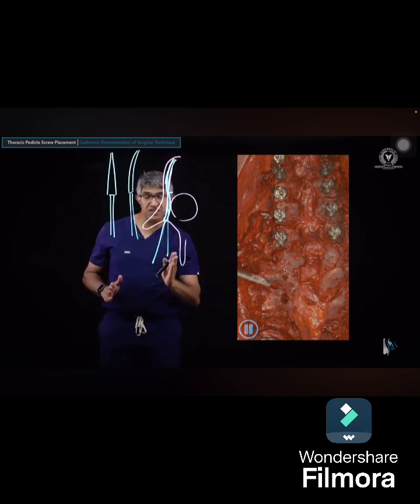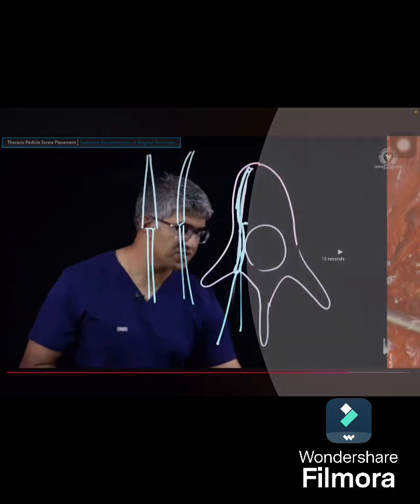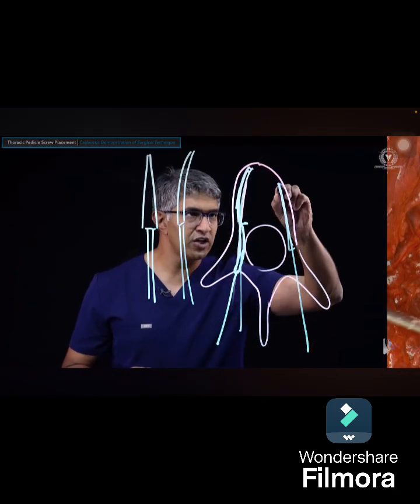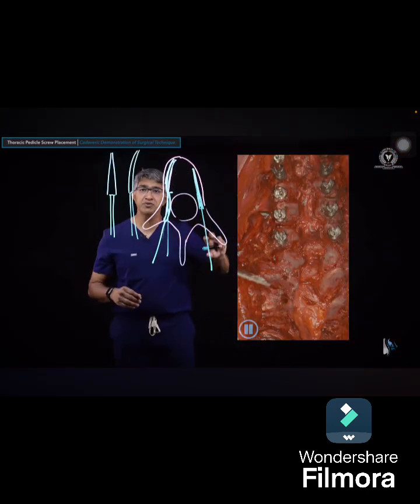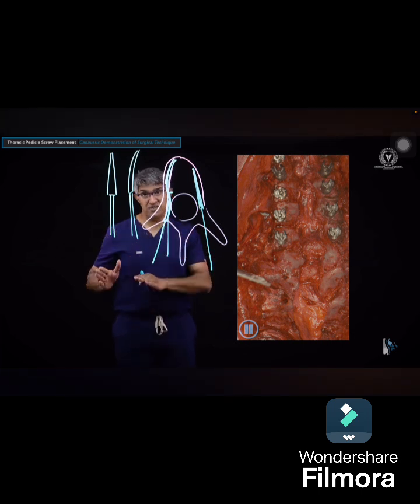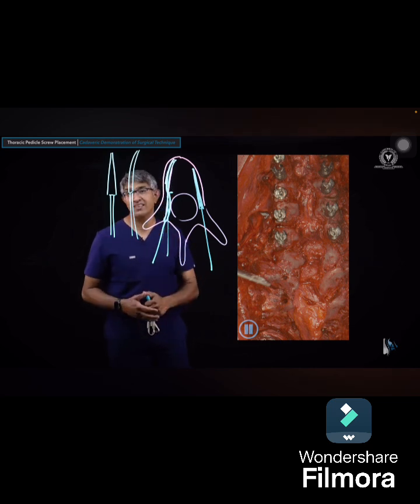I'll tend to do this technique because I feel like it's easier to bounce off that medial edge of the pedicle. Unlike that, if you're putting in a straight gear shift, I tend to just run it down the center here, and the straight gear shift will end up redirecting you. I tend to put it in lightly, using some anisotropic principles, thinking the path of least resistance is usually down the center. That is something I wanted to get into right at the outset because it's a valuable lesson to learn at this point: how to use a curved versus a straight gear shift when you're cannulating a thoracic pedicle.